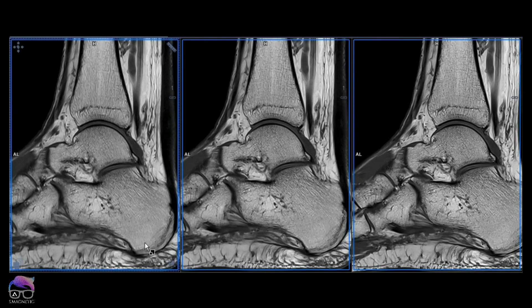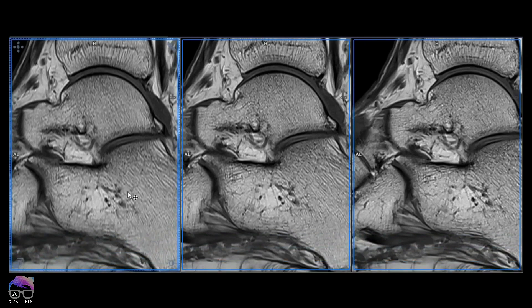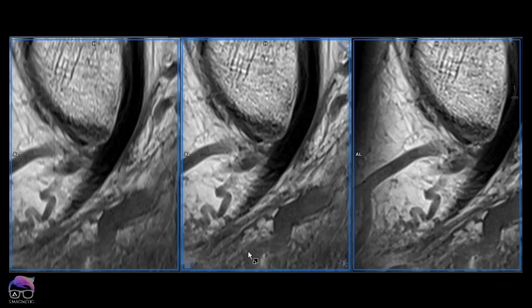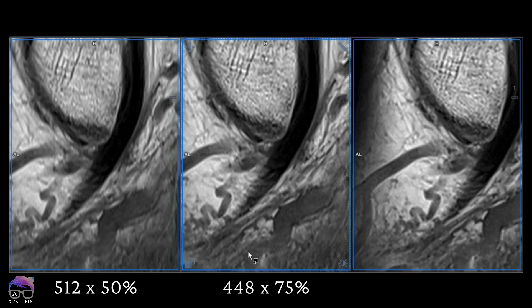Let me zoom in a bit more. Still, the third one is the best. So let me reveal: the first image is 512 × 50% — rectangular voxels. The middle is 448 × 75% — also rectangular. The last is 384 × 100% — square voxels. Even though the square voxel size in the third option is physically bigger than the 512, the square shape produces the sharpest image. Remember: it's not always best to have the highest resolution matrix if you're not setting the parameters correctly.